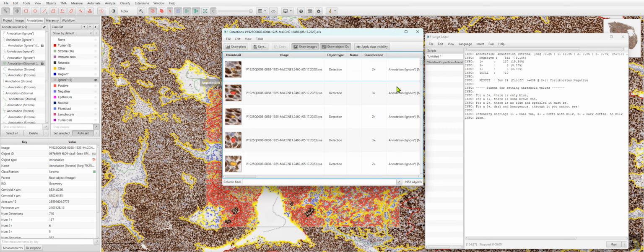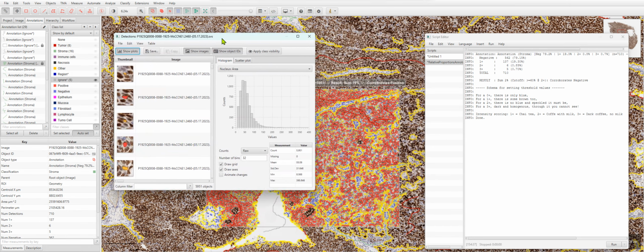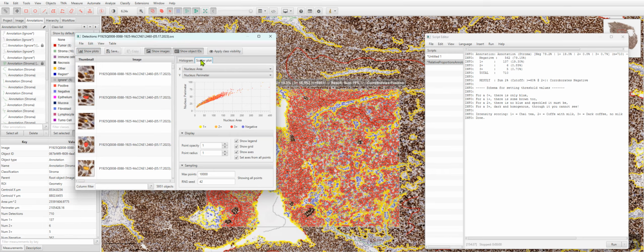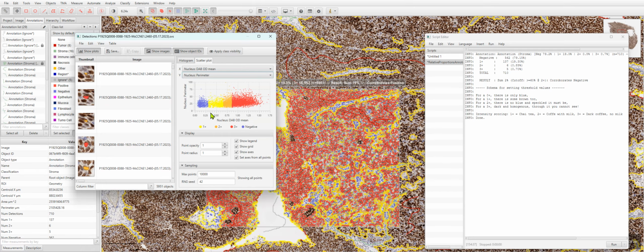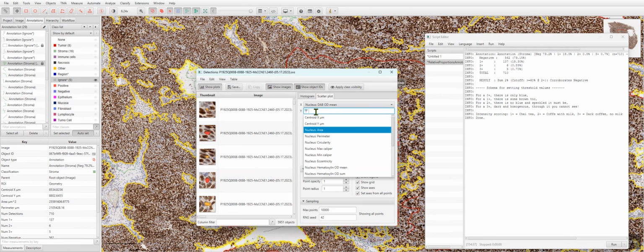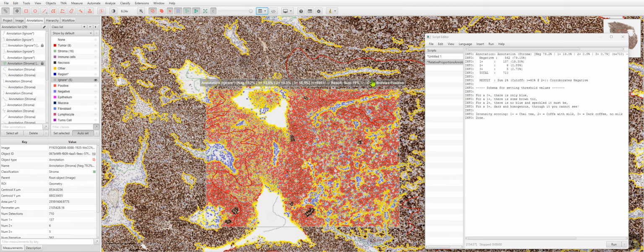Now, if I would like, I can go into show detection measurements. Here's every single cell and its associated measurements, but I'd like to take a look at the distribution of nuclear area, or possibly a scatter plot showing, let's say, DAB versus nuclear area, to take a look at whether the big cells are 3+ or the small round cells. I can look at circularity, are they lymphocytes. It's just a nice way of being able to look at this information in a couple of different ways.